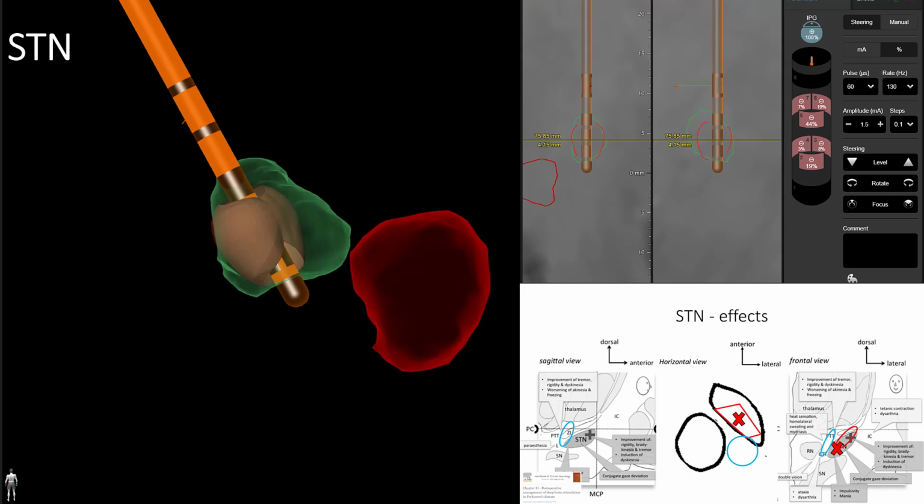And as I mentioned, what you see is a model, and we have not decided on where the optimal area for stimulation is in the STN. Be also aware that many patients with so-called STN-DBS are actually stimulated using contacts above or at the border of the STN, so don't be afraid of using fields of stimulation which extend above the STN.